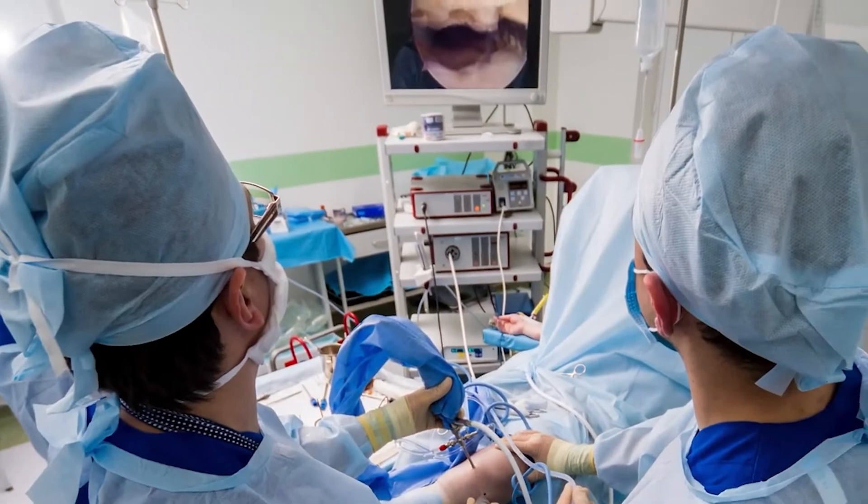Knee arthroscopy, also known as a knee scope, is an outpatient procedure done through three small incisions. Through the small incisions, I am able to insert a camera into the joint to directly see the structures of the knee joint. The camera is fixed inside a larger tube. Water flows around the camera inside the outer tube to fill up the knee joint. The fluid is held inside the capsule, resulting in increased pressure, which serves to decrease bleeding and to separate the knee structures for visualization. The first part of the knee scope is the diagnostic portion, during which the entire visible portion of the knee joint is inspected and probed. The preoperative diagnosis is confirmed and other injuries can be identified.